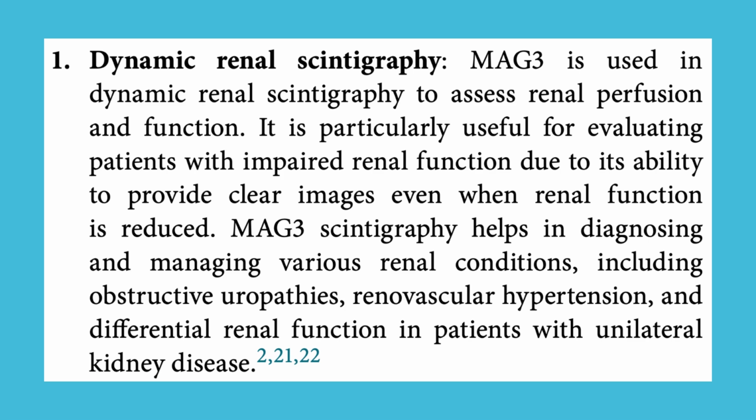1. Dynamic renal scintigraphy. MAG3 is used in dynamic renal scintigraphy to assess renal perfusion and function. It is particularly useful for evaluating patients with impaired renal function due to its ability to provide clear images even when renal function is reduced. MAG3 scintigraphy helps in diagnosing and managing various renal conditions, including obstructive uropathies, renovascular hypertension, and differential renal function in patients with unilateral kidney disease.